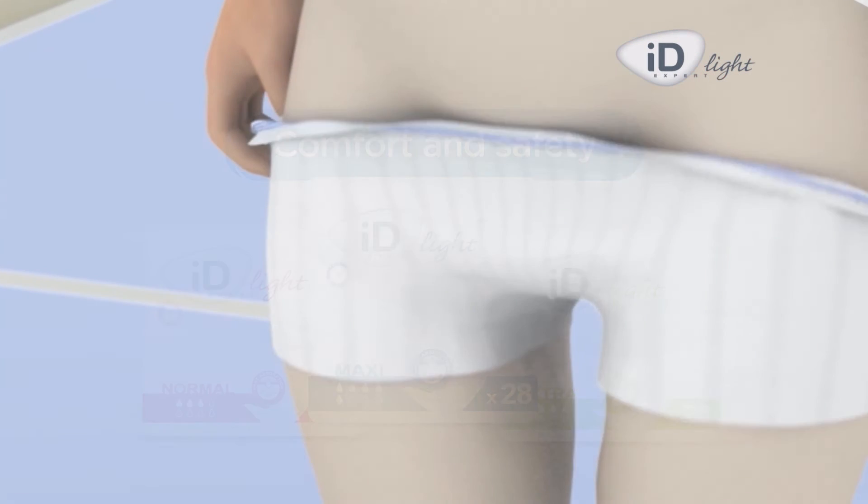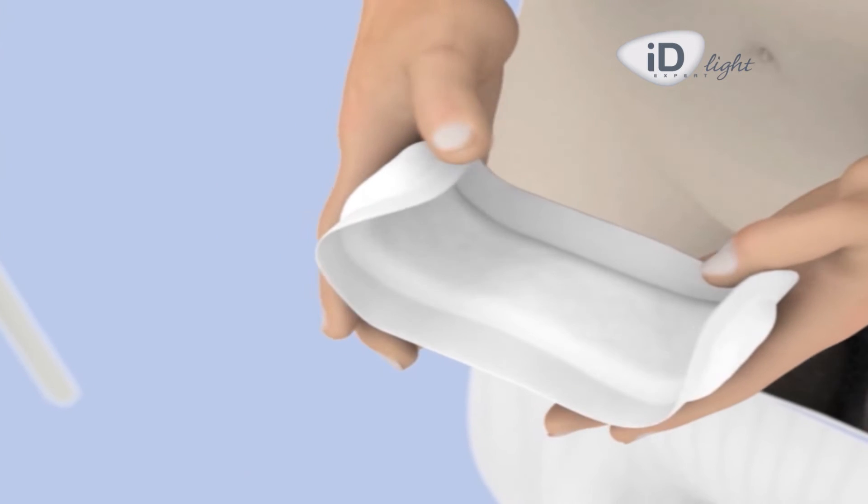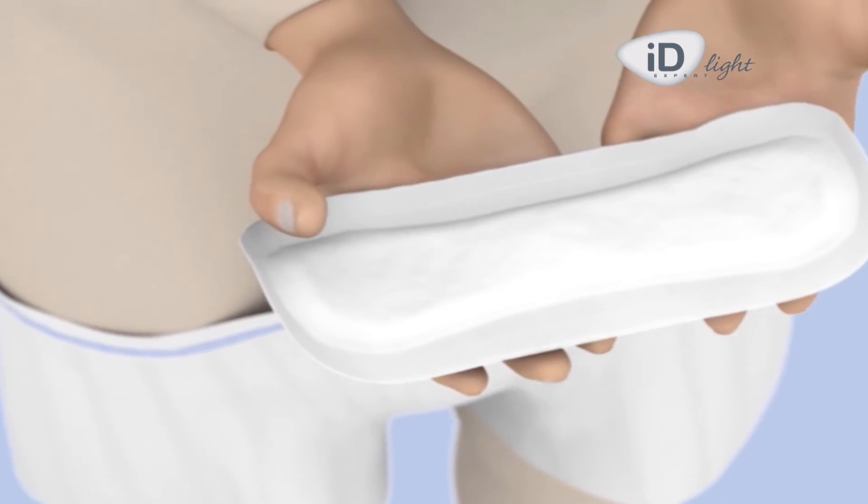Start by lowering the undergarment to the knees. Take the product out of its pouch and unfold it, using both hands to gently bend it lengthwise so that it forms a channel.